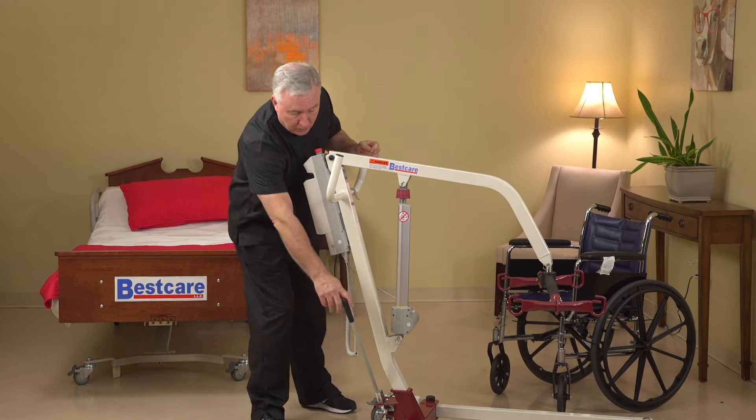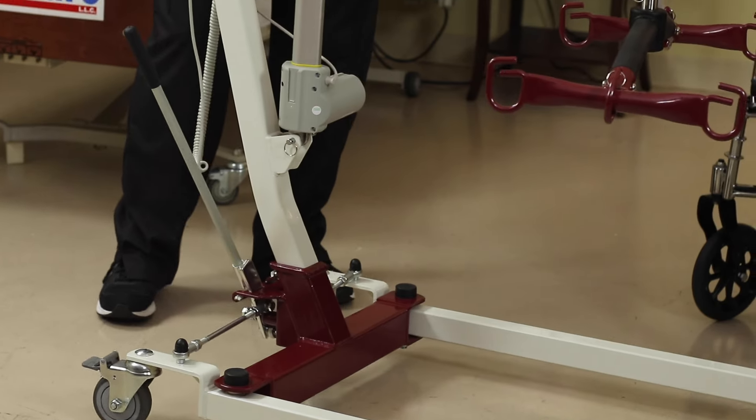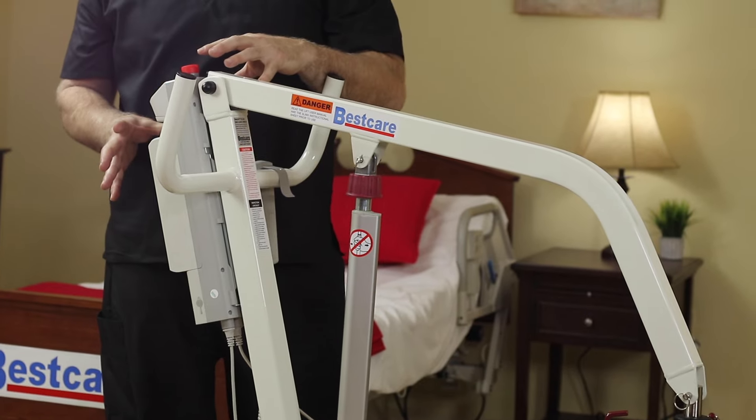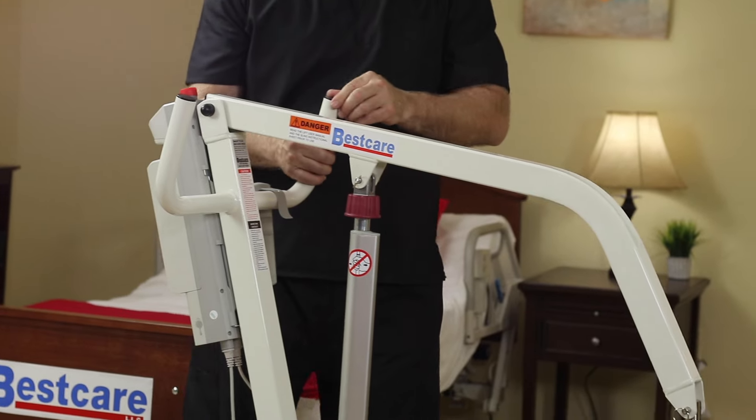For example, the base opens and closes the exact same way as those units with a stick shift on the back. The electronics are mounted in the back, although we use our new electronic system with the 182 and 228, which is a more advanced user-friendly system.